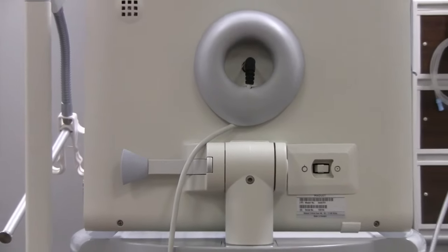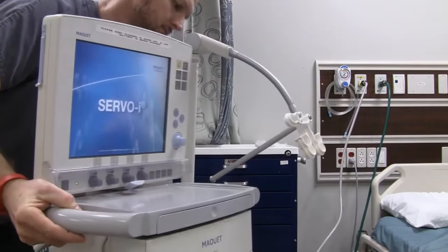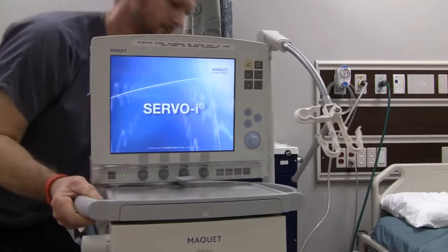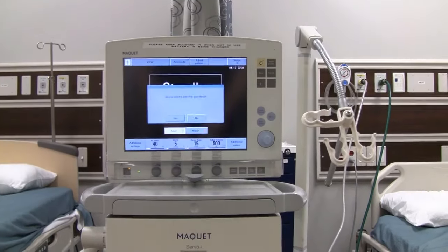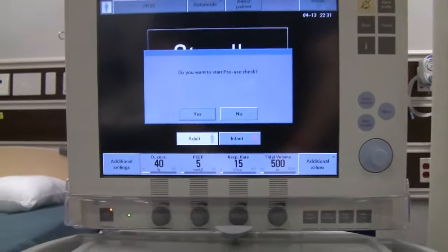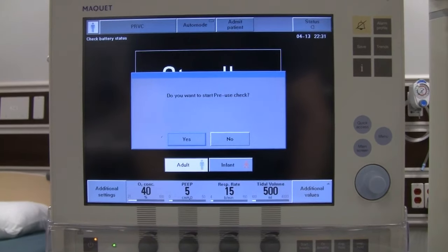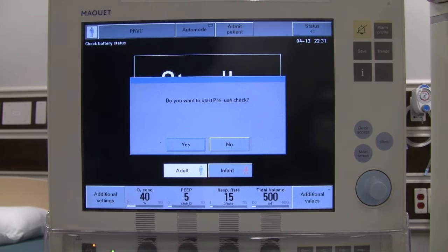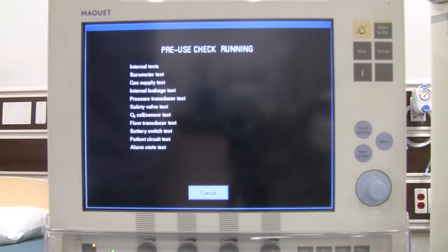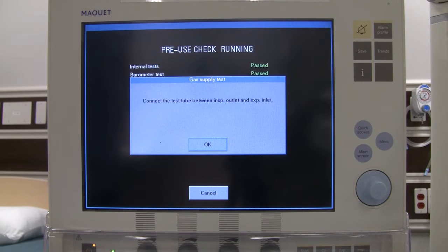The machine will start to boot up. As soon as it boots up it will ask if we want to do a pre-use check — we always want to do this unless we know it has been done previously and the ventilator is ready to use. We say yes and let it start up. Now connect the test tube between the inspiratory outlet and the expiratory inlet.